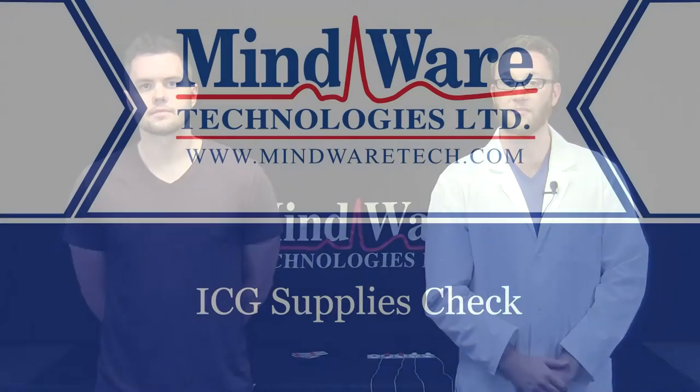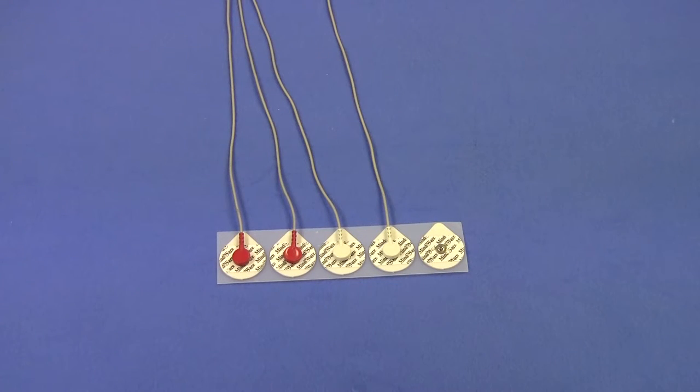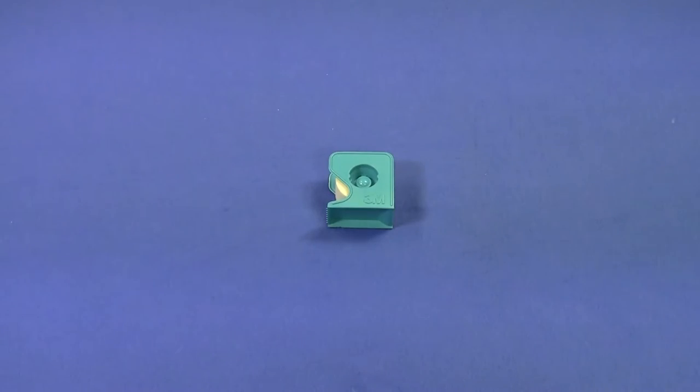Since cardiac impedance is typically used along with ECG, the subject has already been prepped for collecting ECG. First, let's take inventory of the necessary supplies for collecting cardiac impedance. To collect cardiac impedance we need four ECG medical sensors or electrodes with four lead wires attached, alcohol prep pads, and micropore tape.